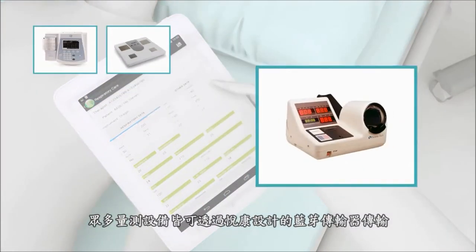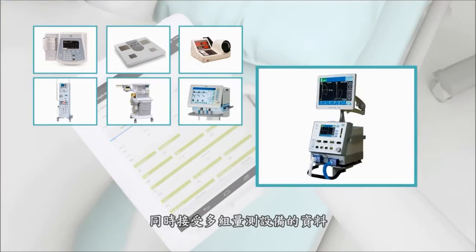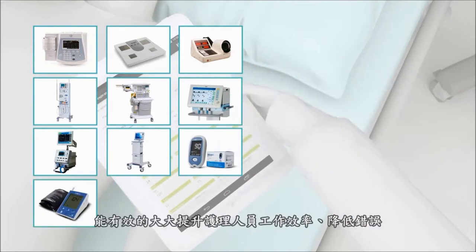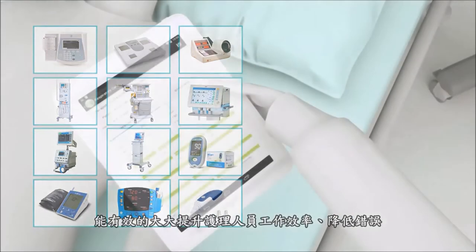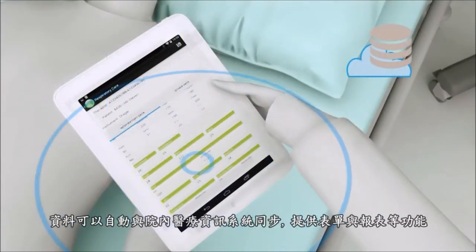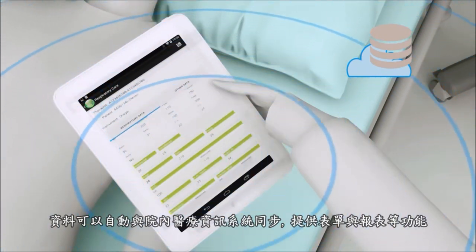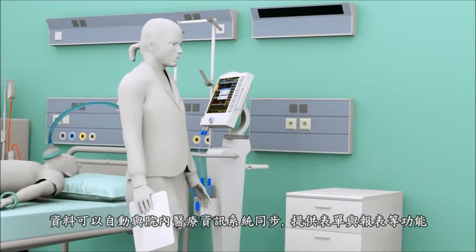With patented YDOS data transfer, simultaneous multi-machine data transfer is possible, hence reducing staff workload and errors. Data syncs automatically with intra-hospital system to facilitate charting and reporting.